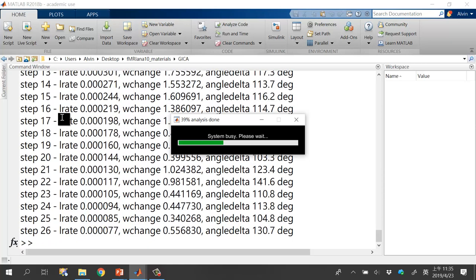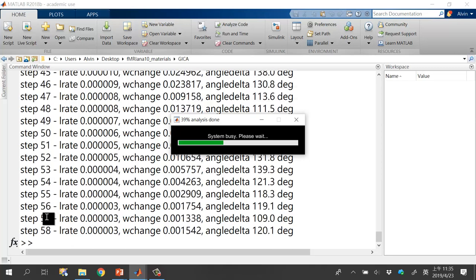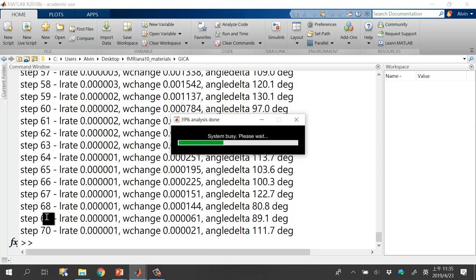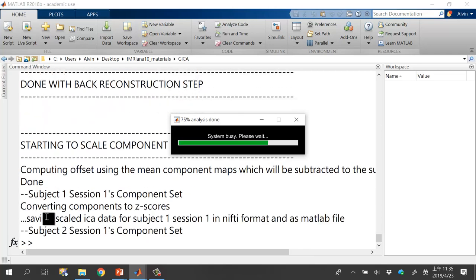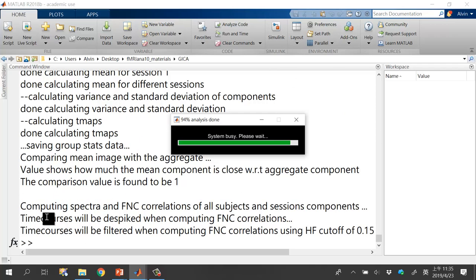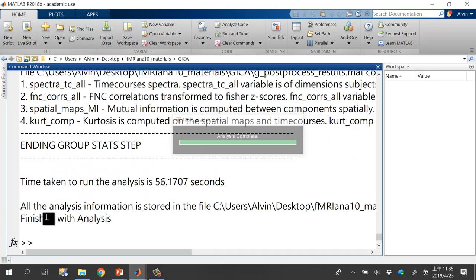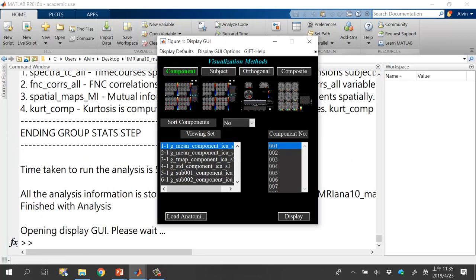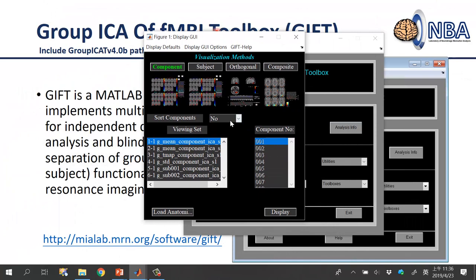During analysis, you can watch the iteration count. If the step number goes very high — for example 1000 — without stopping, the algorithm failed to converge. In that case, try adjusting the number of IC components or verify your data input. If everything is correct, after about two minutes the Display GUI window will automatically pop up.